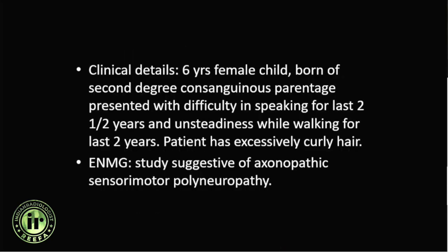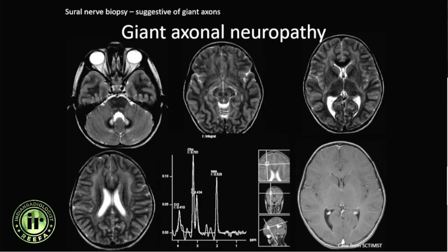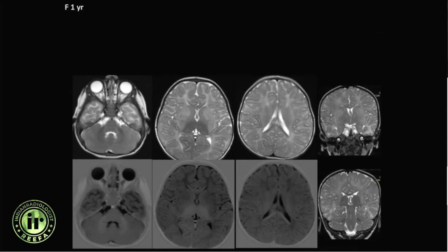Another patient — a six-year-old with abnormally curly kinky hair and sensory-motor neuropathy on EMG — showed diffuse white matter changes, abnormality in the dentate nuclei, and spectroscopy showing non-specific increase in the choline-to-creatine ratio and reduction in NAA. Diffuse white matter changes also involved the corticospinal tracts. This is giant axonal neuropathy.